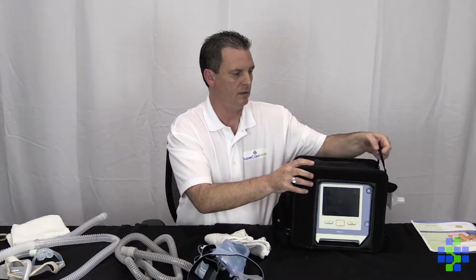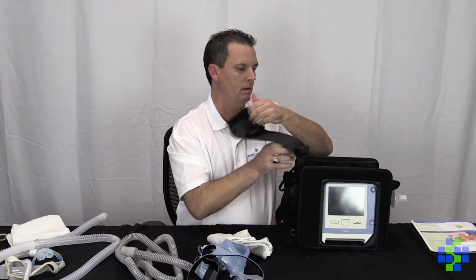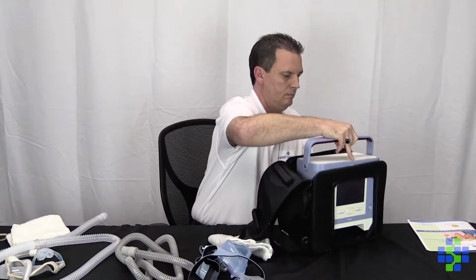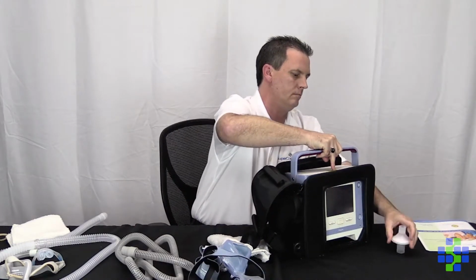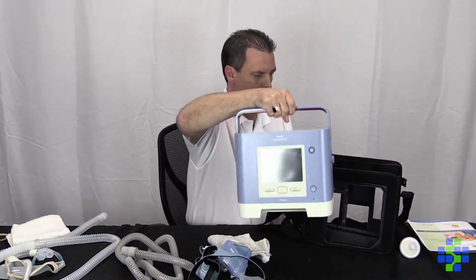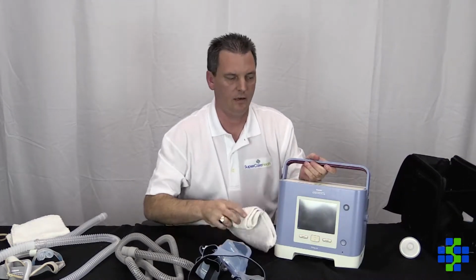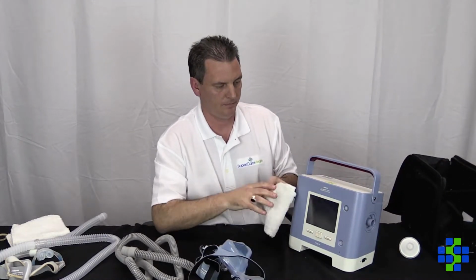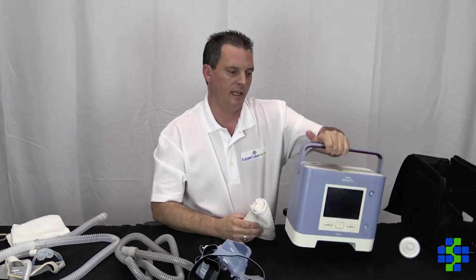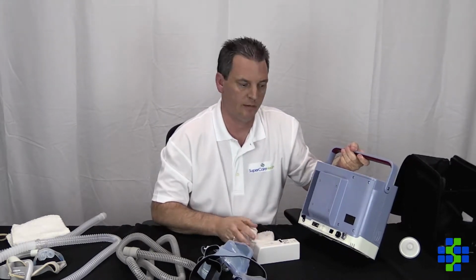And often I would remove it from the bag. So maybe once a week I would take it out and I would wash it with soap and water. I would just kind of wipe it down with some soap and water around the outside. Make sure we don't get any soap and water in this area because it will damage the machine.